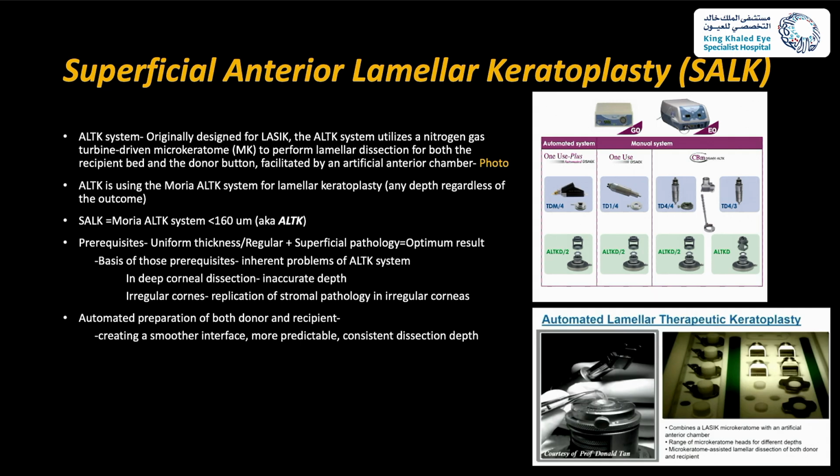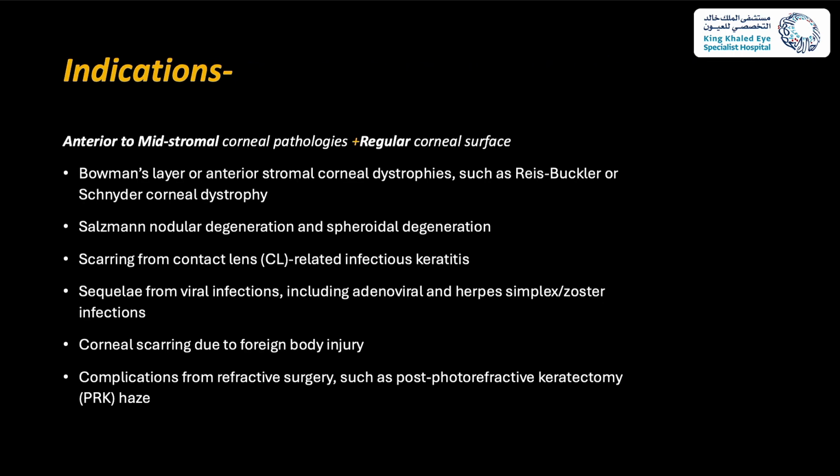However, the system allows for smooth interface dissection, more predictable and consistent dissection depth in the superficial layers. What are the indications? Basically, any anterior to mid-stromal corneal pathologies with regular corneal surface.